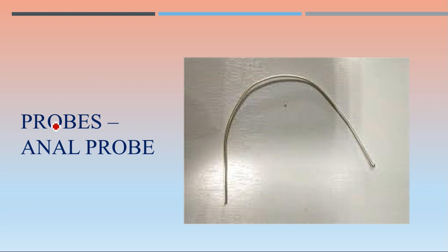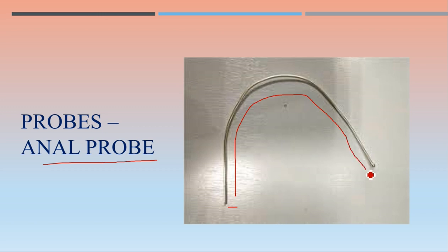This is an anal probe — one of the miscellaneous instruments. It is a long cylindrical-like structure, slender, and is basically used for calibrating anal fistulas and peri-anal fistulas. It is very flexible and can be molded in any direction as needed.